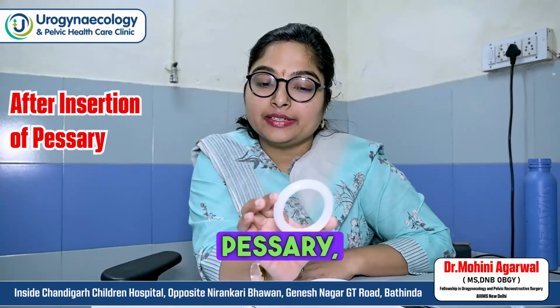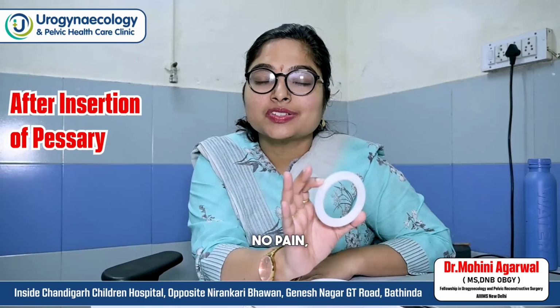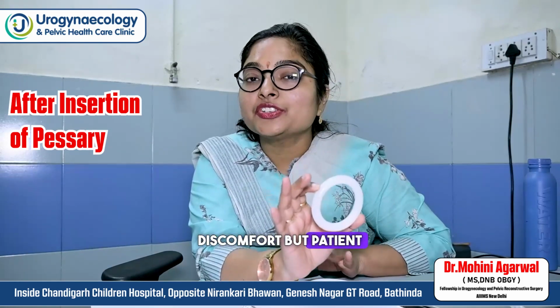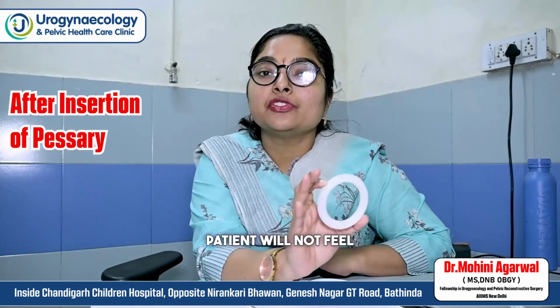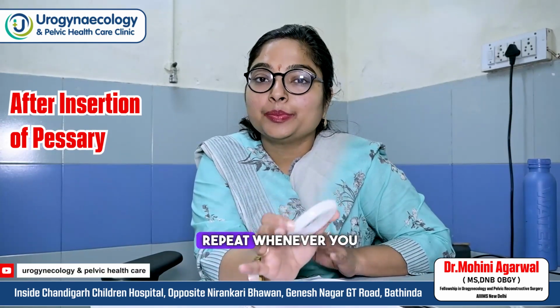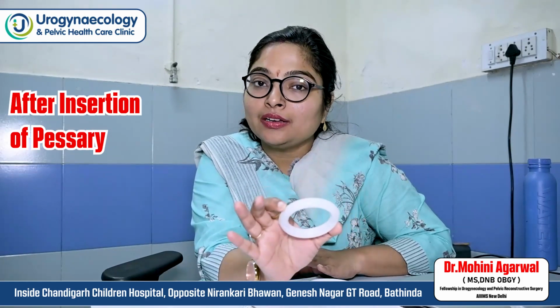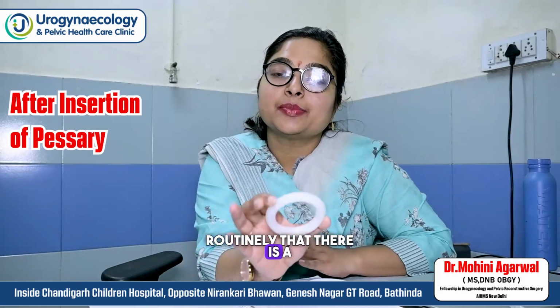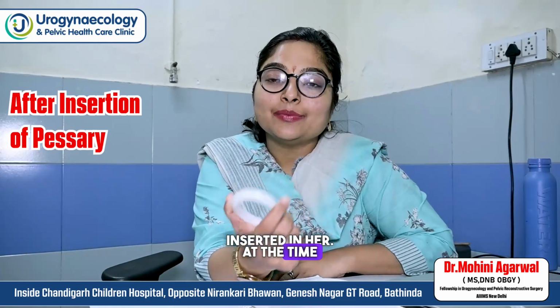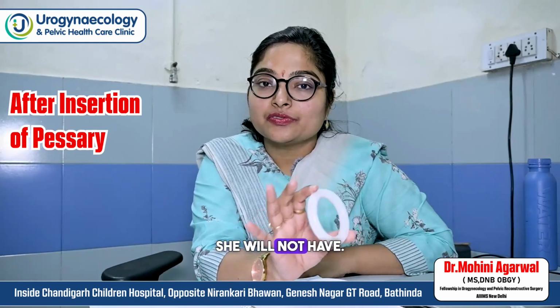Whenever you insert a pessary, your patient will have no pain. She may have slight discomfort, but routinely a pessary patient will not feel that she has a pessary inserted. I repeat, patient will have no pain. She will not feel the pessary routinely. At the time of insertion, obviously there may be some discomfort, that is okay, but routinely she will not have it.